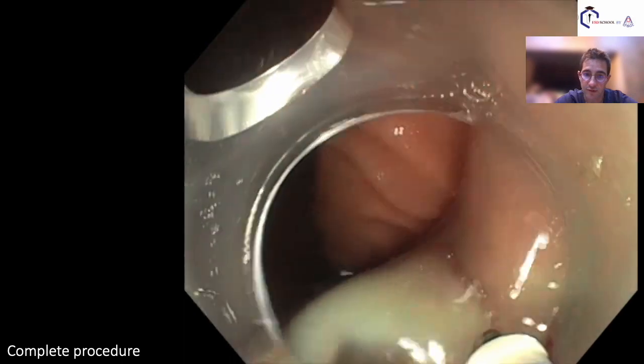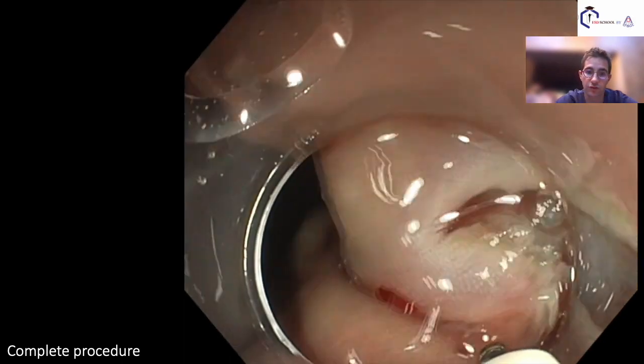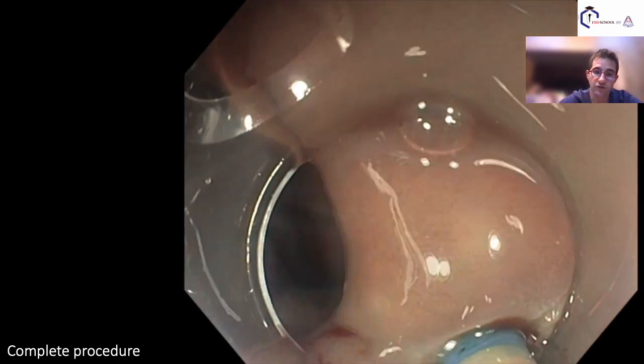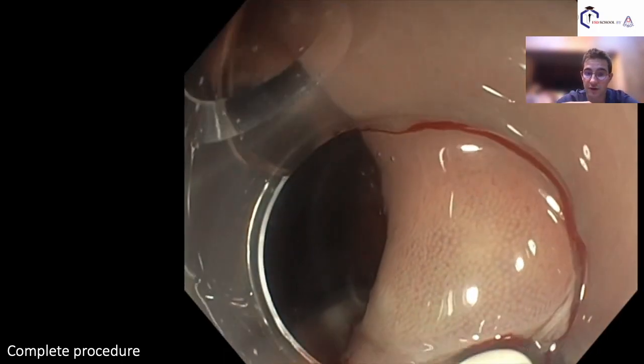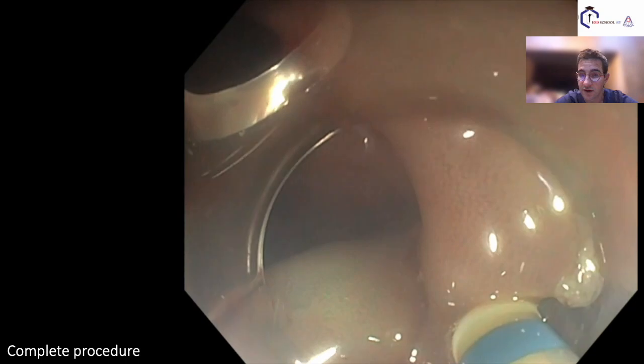So here the scope control was not very good. It was difficult to remove my hand from the scope because the position was not really stable, and therefore I fixed the lens of the device, and I chose to move the scope itself as a tool and not only the knife.